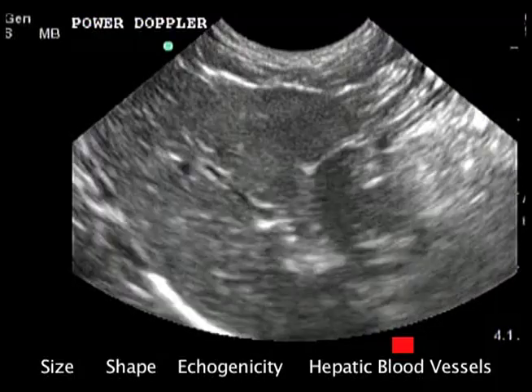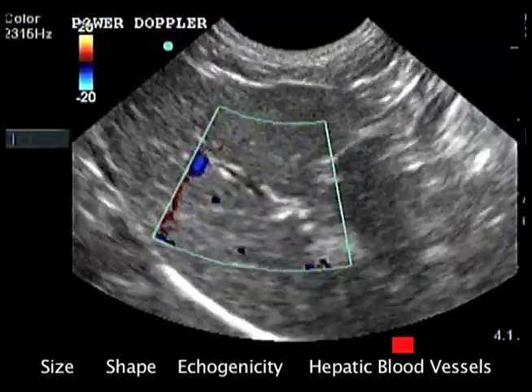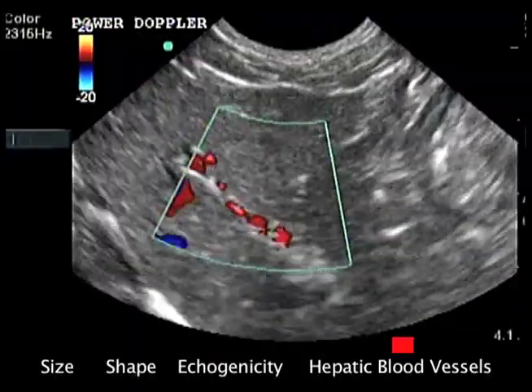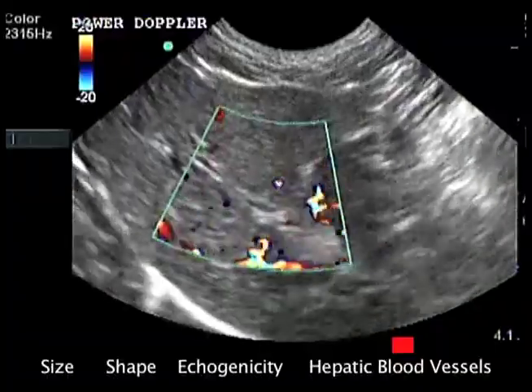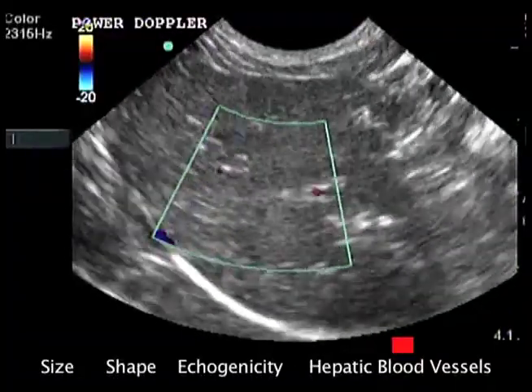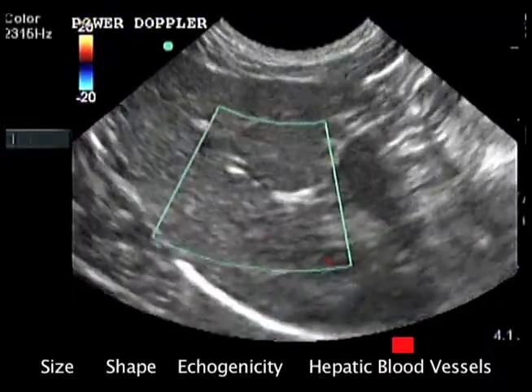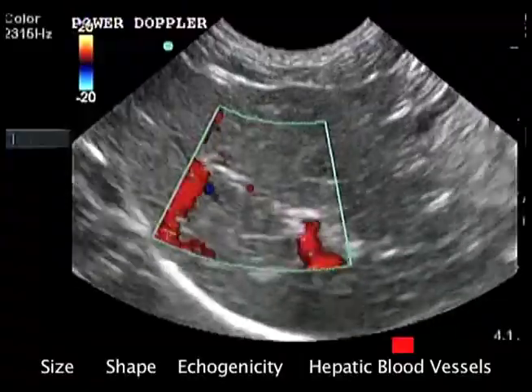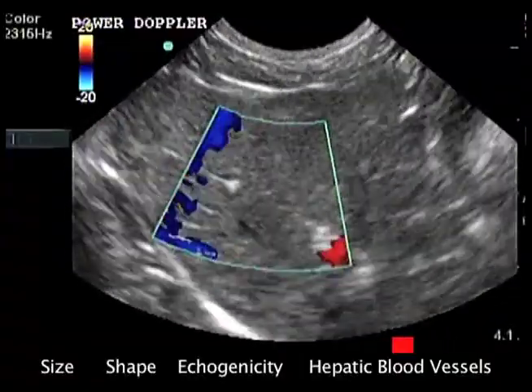Color flow Doppler shows direction of blood flow in vessels. By adjusting scale, it can also give an idea of flow velocity. Color flow Doppler requires a tremendous amount of computer capacity and tends to slow the frame rate of the video image. In most small ultrasound machines, color flow does not work well at deep depths.